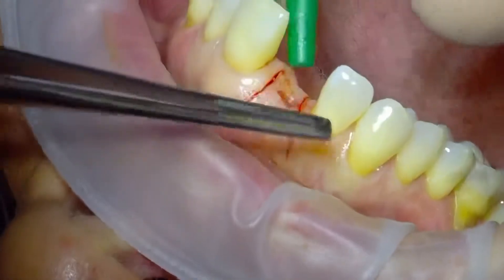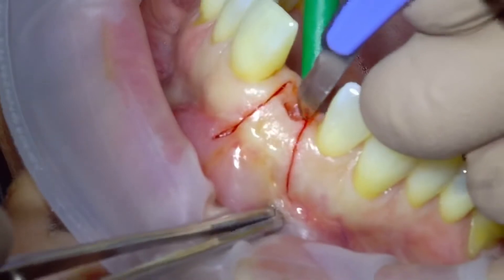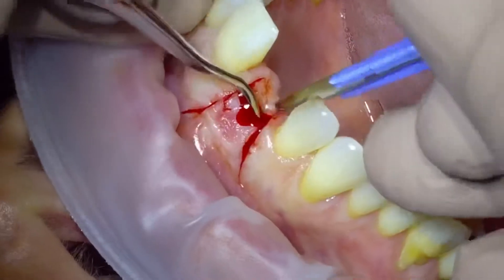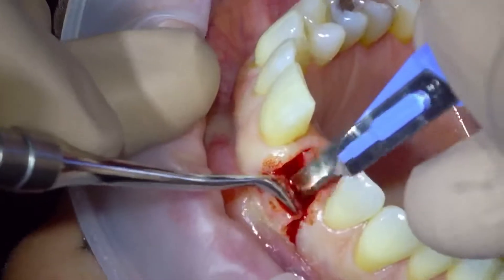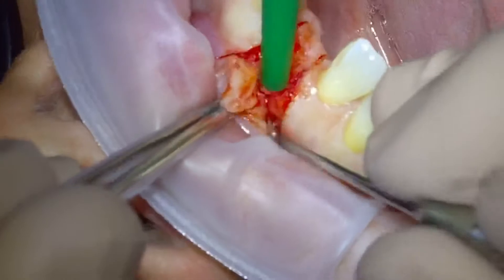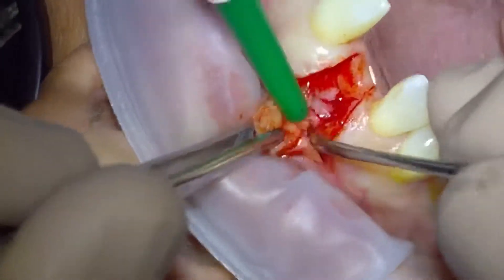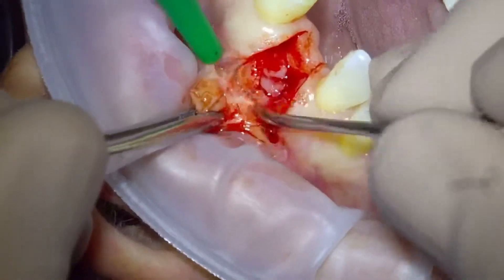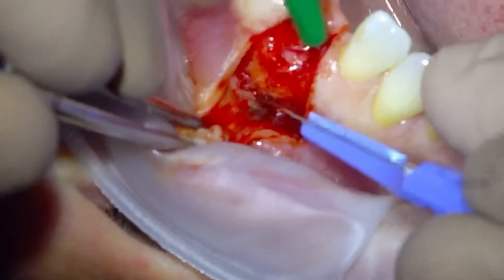You can see the previous scarring from a history of apicectomies following a trauma, which I think was an equestrian accident. Then we just make the crestal incision and start reflecting that back. You can see we just ease it back and dissect through, just trying to move the tissues preserving the periosteum. Sometimes it's quite difficult when it's scarry.